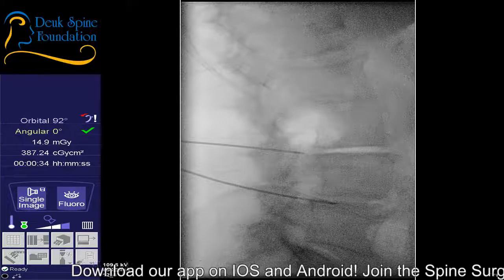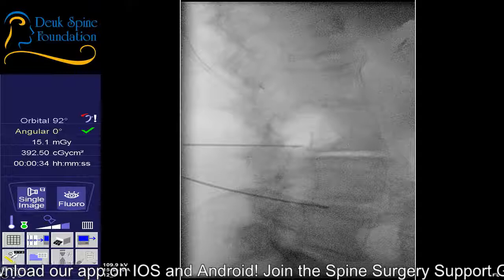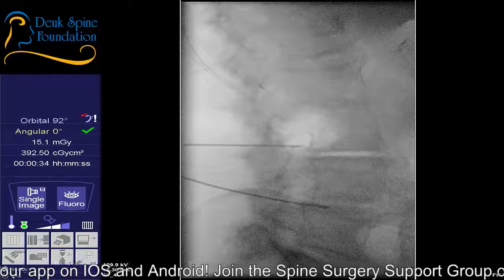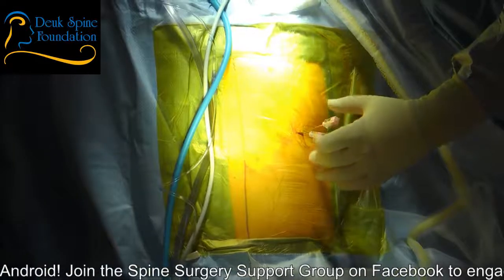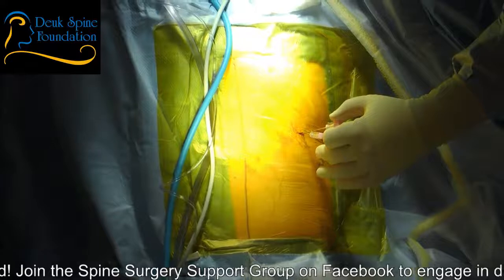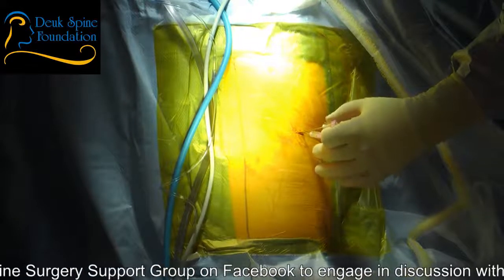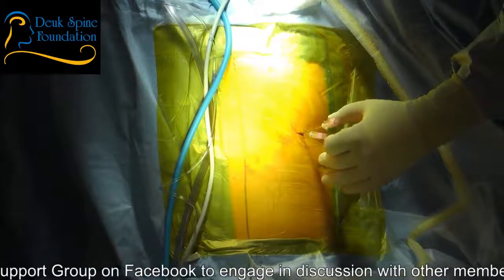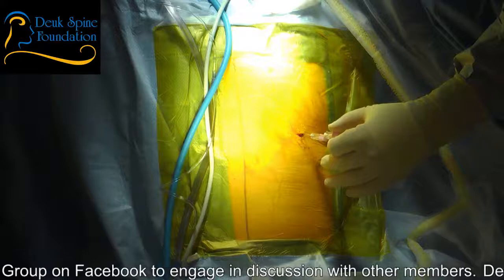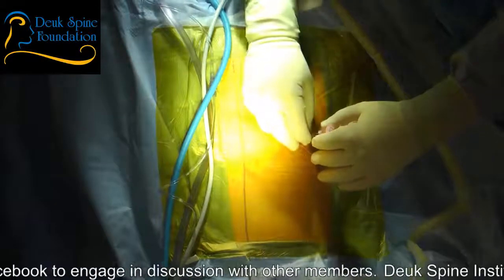Where do you feel it? Where? Okay, thank you. Now? Better? I can't hear her. No, I'm having the pain right now. All right, good. Not going down the leg. Yeah, you're fine. You're fine. Remember, we're working around that pinched nerve, so once in a while you might feel something. Don't be alarmed. We're correcting it, so you won't feel it.